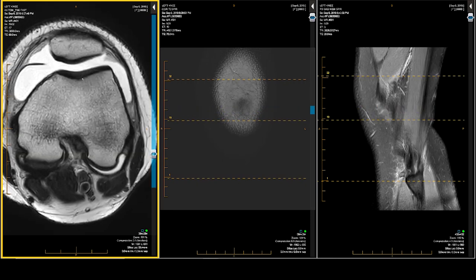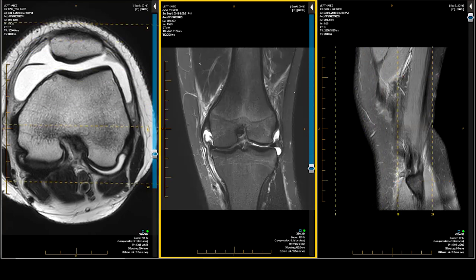T2 imaging is there to help you with injury dating — is it old, is it new, is it subacute? So it is not a detection sequence. It is a refinement sequence. The fat suppression T2 is pretty good, but not my first choice for detection.